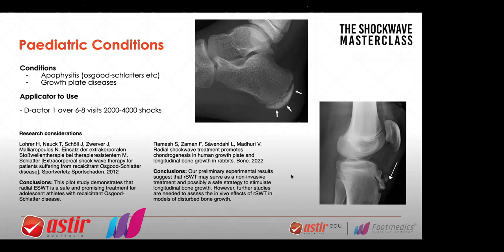You would apply it directly over the point of pain within their painful limits, building up over time. If you can only do 0.5 bar or one bar with the D-actor — fine, you're still going to get change. You'd be surprised how much they improve with very low intensity. I do want to get higher within their pain limits over the different sessions, and it can be applied in multiple different directions. For the tibial tuberosity where Osgood-Schlatter is — as that bony eminence comes out and the attachment of the tendon — you can go around that bone either side, either direction going from lateral to medial or medial to lateral, inferior to superior. Point and shoot is the principle. Where does it hurt? Go there.